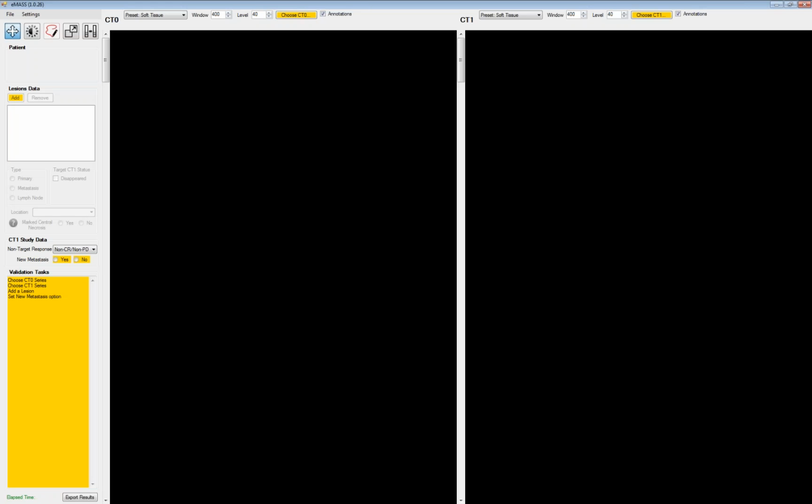But you may be asking yourself, what's the availability of eMass? Where is it in the process? What you're going to see here is the workstation version of eMass that Andrew is using in his research. If you're a radiologist interested in this kind of research and in being part of this, you're welcome to contact ImageIQ or Andrew. If you're running a clinical trial and having eMass and quantitative data available is interesting, you're welcome to give ImageIQ a call. We've got a couple of incarnations of it that we can show you. So with that, we'll turn over the demo to Andrew and let him dazzle us with the eMass amazingness.